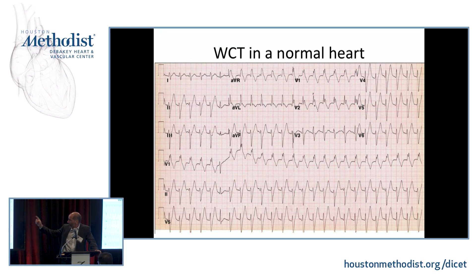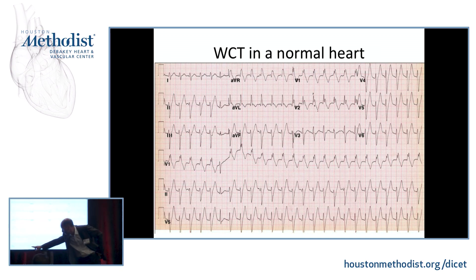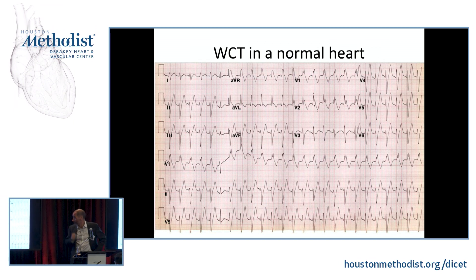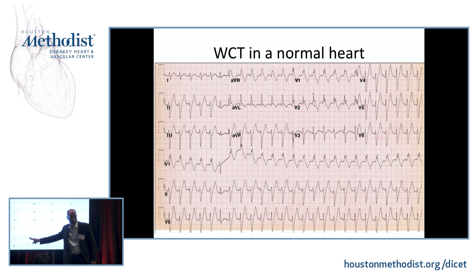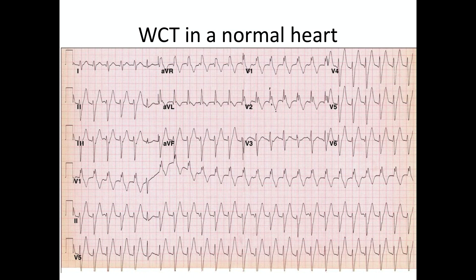An example of VT in a normal heart: tachycardia with right bundle branch block pattern and left anterior fascicular block — small R waves and deep S waves in leads II, III, and aVF. This is a young patient with syncope and no structural heart disease. A capture beat confirms AV dissociation and VT. This is fascicular tachycardia, also called verapamil-sensitive VT or Belhassen's VT, originating from the left posterior fascicle.